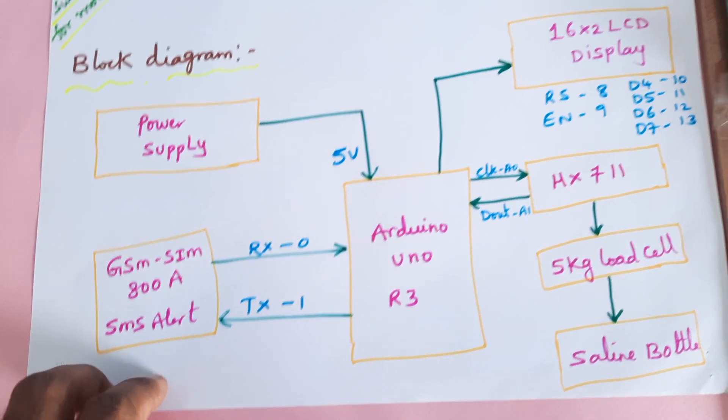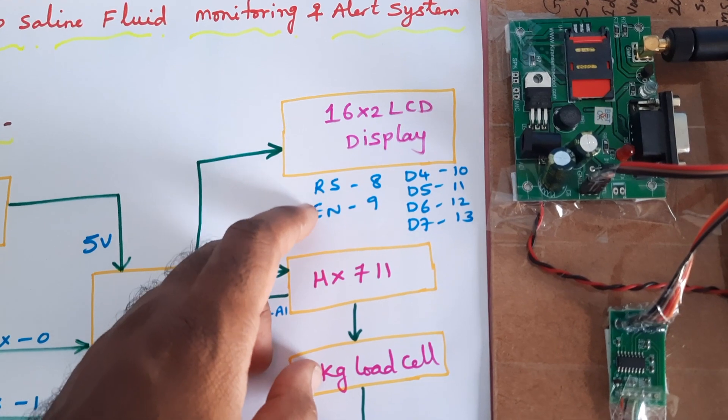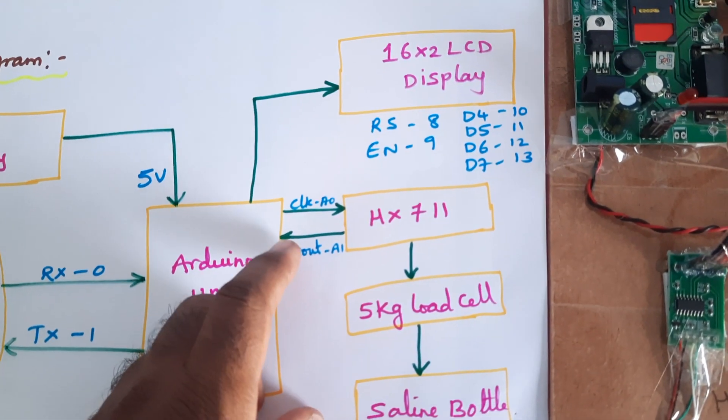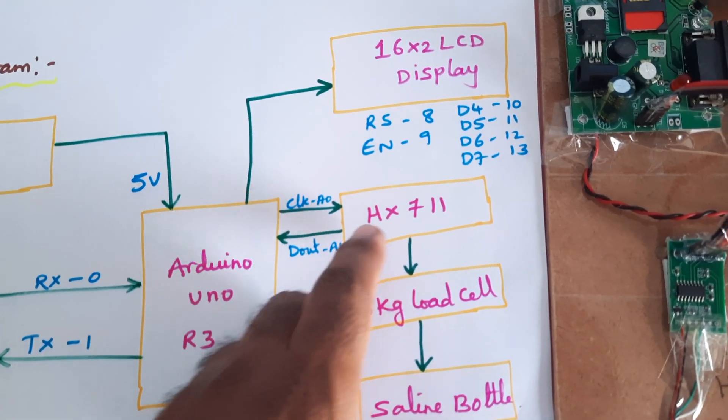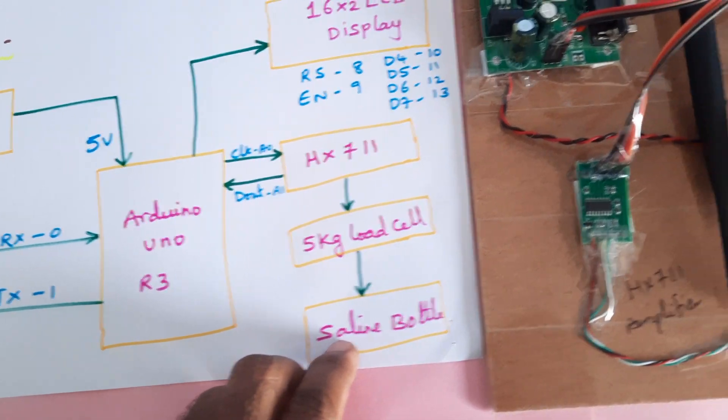For SMS alert purpose, we are using Arduino Uno R3, 16x2 LCD display, RS, EN, D4, D5, D6, D7, pins 8, 9, 10, 11, 12, 13, D-out, A1, clock, A0, HX711 amplifier, and a 5 kg load cell and saline bottle.